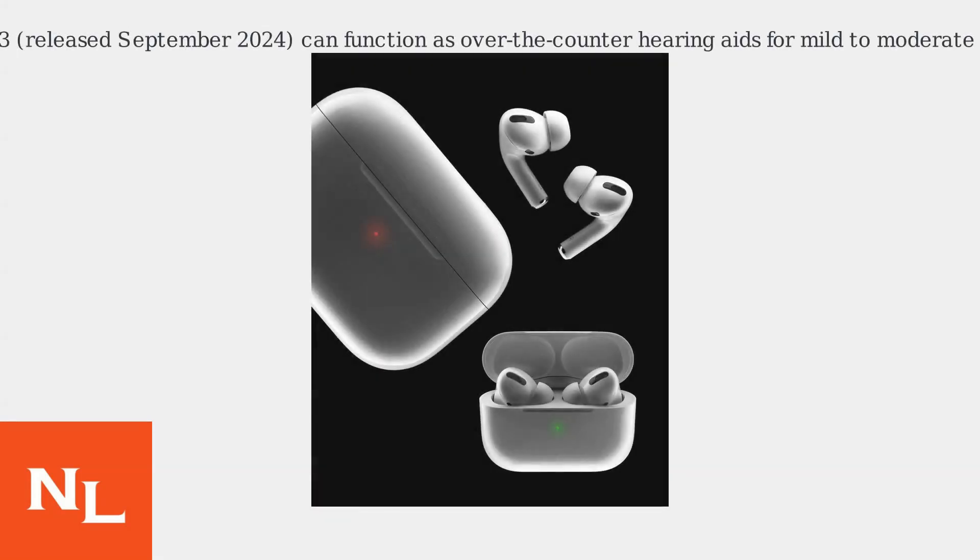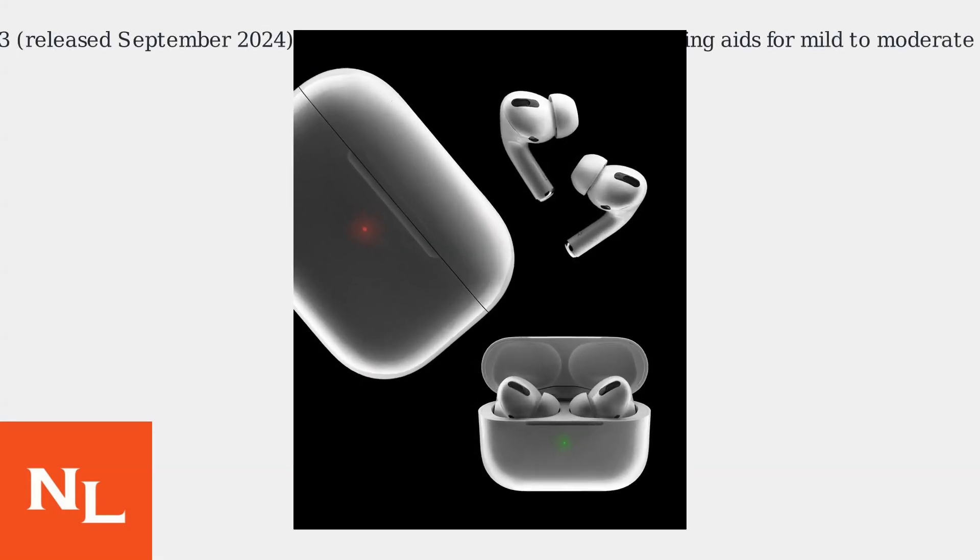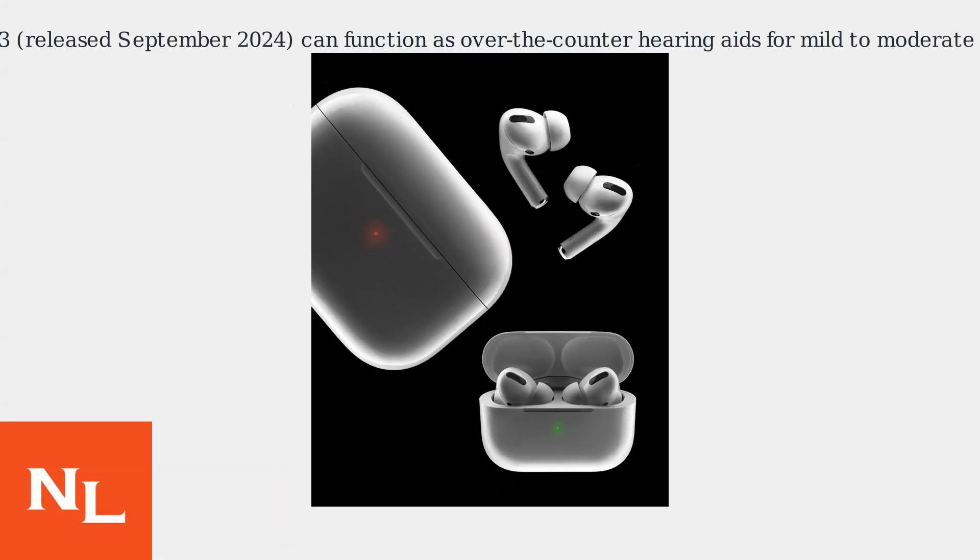AirPods Pro 3, released in September 2024, can function as over-the-counter hearing aids for mild to moderate hearing loss.